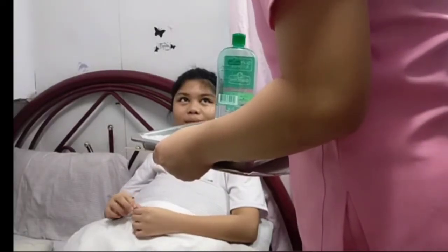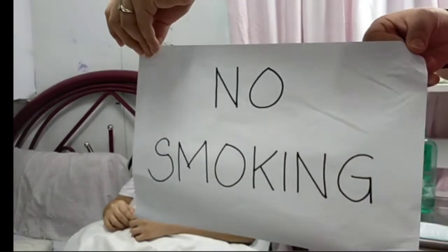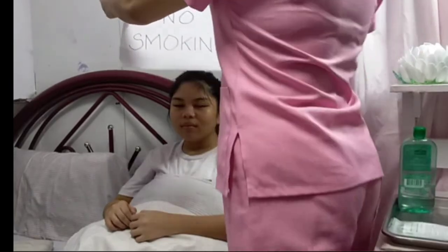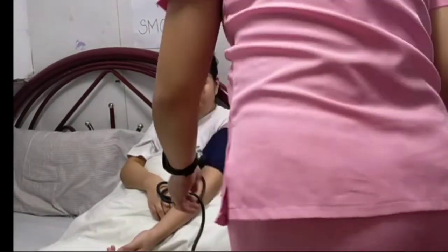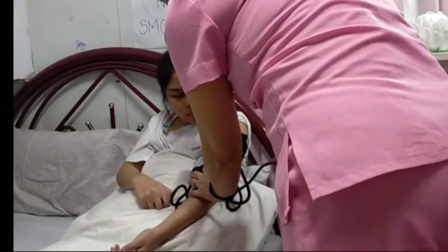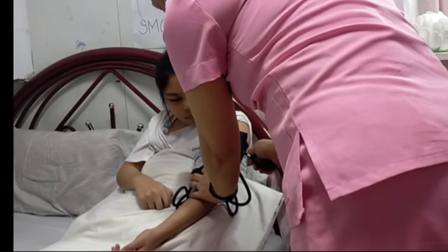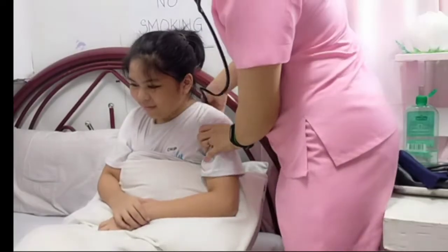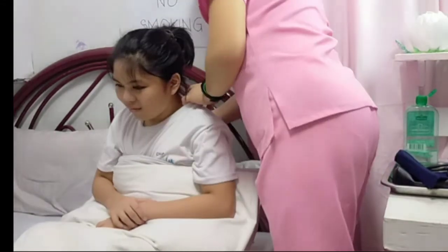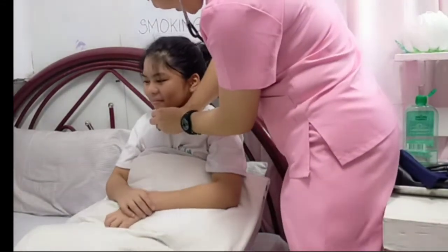Introduce yourself upon entering the patient's room. Post a no smoking sign on the patient's wall. Check vital signs to monitor the patient's status before receiving oxygen therapy. Check for any abnormal lung sounds with the stethoscope and refer to the physician.